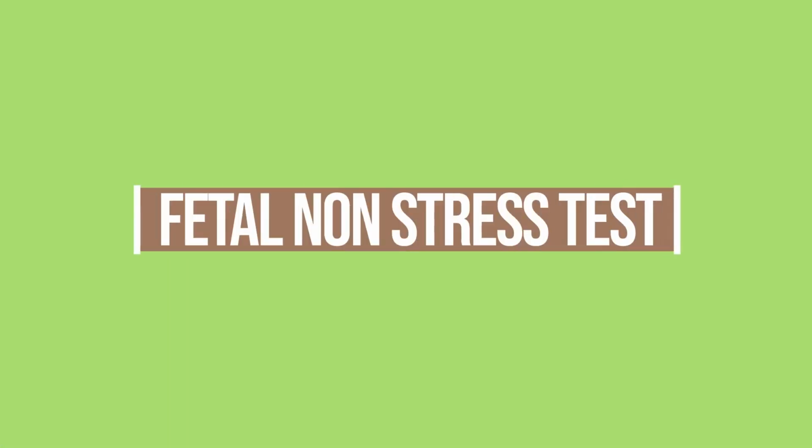Dr. Boyd here. Today we're talking about the non-stress test, or the NST, or the Fetal Non Stress Test. What is this test? When is it performed? Why is it performed? And who is it performed on? The non-stress test is an evaluation of the fetal heart rate.